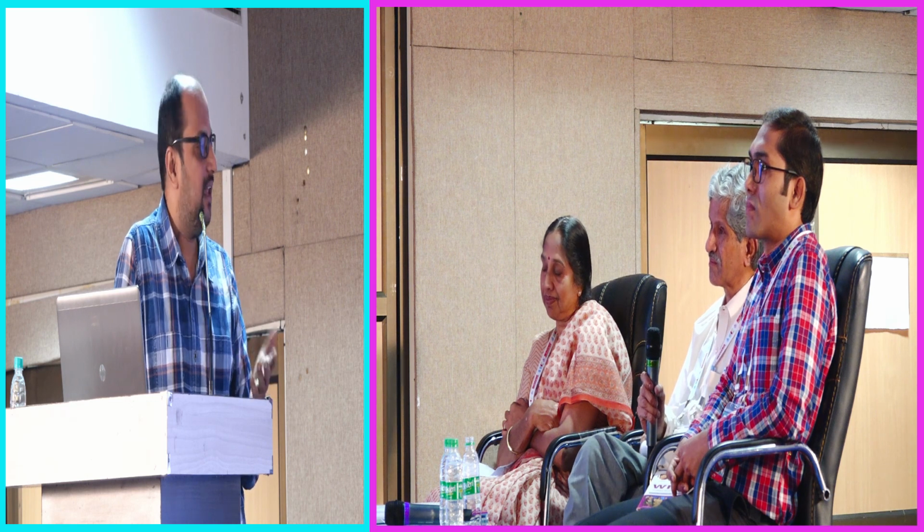What's your filter life without anticoagulation? Without anticoagulation, filter life is almost 48 hours on average. But I have seen filters getting clotted in 6 hours also. It depends upon the patient's health status. In some patients, the platelet count is low and the INR is high. But if they are in disseminated intravascular coagulation, rather than getting microclots in the body, we have seen the clots getting deposited in the filter, and the filter life is only 6 hours. But on average, what we have seen is that we can run 36 to 48 hours without anticoagulation.